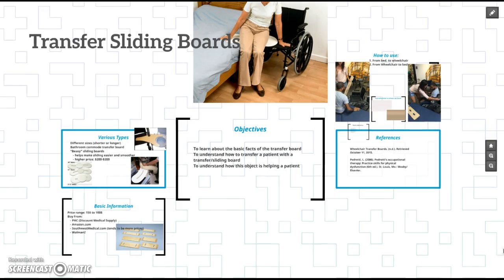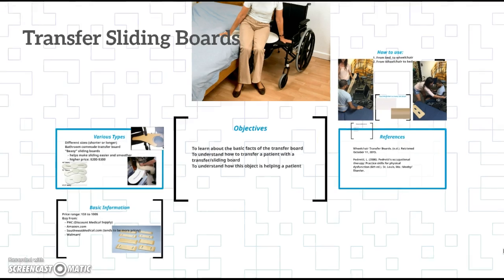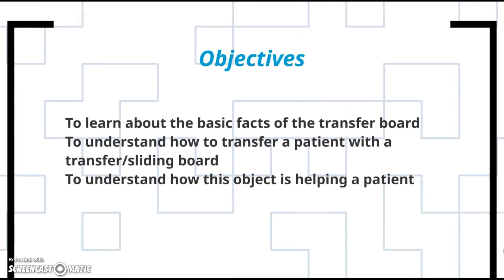Okay. Hello, this is Abby Lyle, and today we are going to discuss the purpose of the transfer sliding board. Our objectives today include learning about the basic info and facts of the sliding board, understanding how to transfer a patient with the sliding board, and understanding how this object is helping the patient.